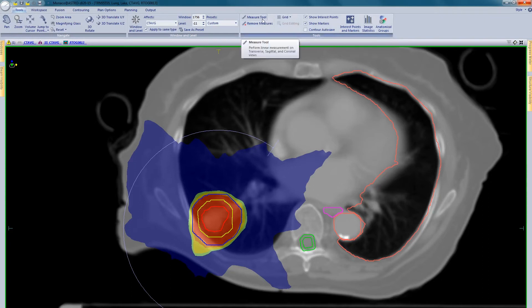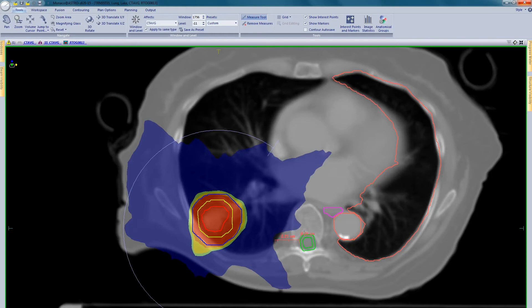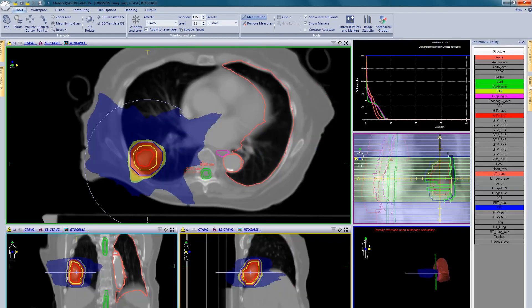However, we can also use our Monaco plan to determine our CSA limits in a similar way, and this does the work for you. The measuring tool can be used to measure the distance between the critical structure and isodose structure, or the PTV, in all axes. This would be done in collaboration with the physician who knows the history of the patient. In this example, whilst the spinal cord is not in close proximity to the tumour, the patient has had previous treatment and the physician wants to limit the dose to the spinal cord to 12Gy. We have therefore used the 12Gy isodose line to measure and determine the limits on our critical structure avoidance.